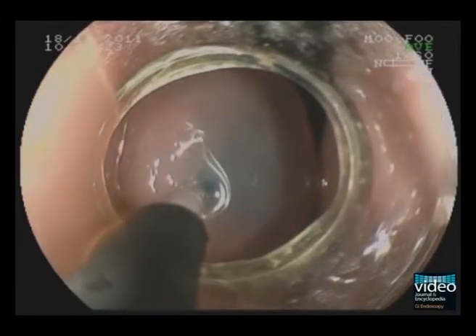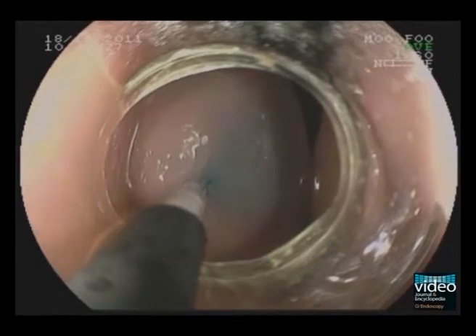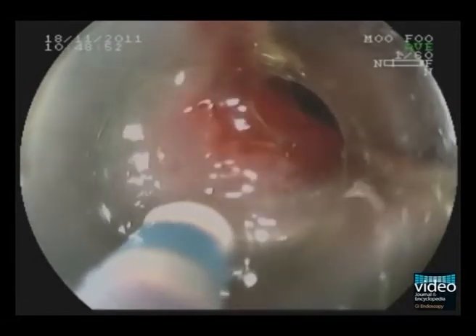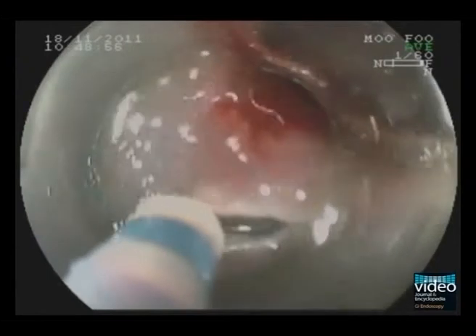Now we start with the resection. First we perform injection of the marginal area with hydroxyethyl starch and hyaluronic acid in retroflexion. Then the marginal cutting is started using the dual knife. This cutting is slow in order to prevent bleeding.